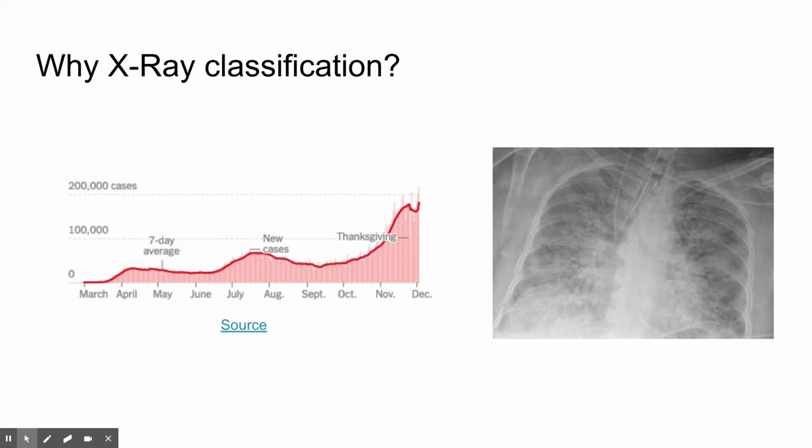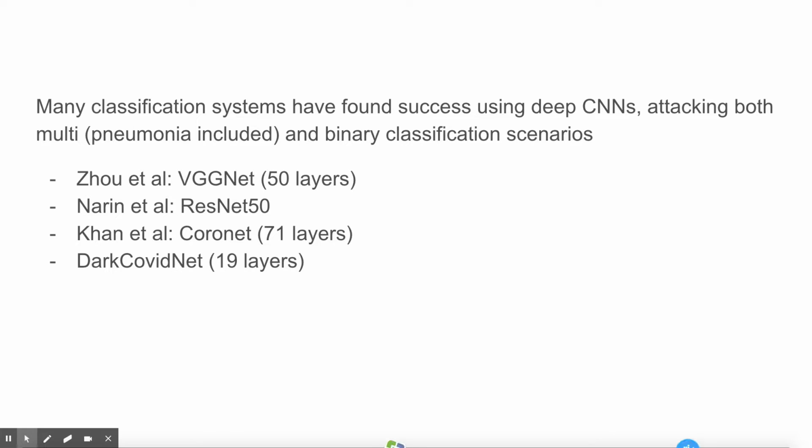So we will be going over an X-ray COVID detection model that was built upon a prior model called DarkCOVIDNet to be more on par with other gold standard models in this scenario. So within this area, several models have been proposed for both binary and multi-class scenarios. Multi-class scenarios would include COVID and healthy patients as well as patients with pneumonia, which would better reflect real-world scenarios.